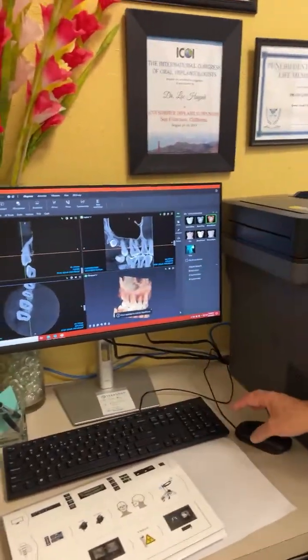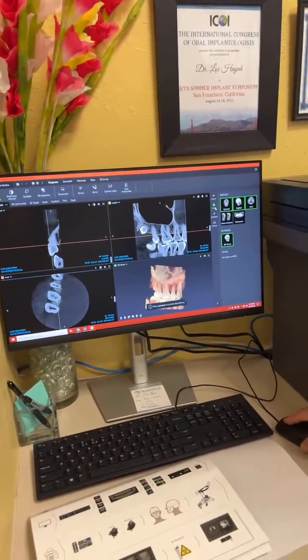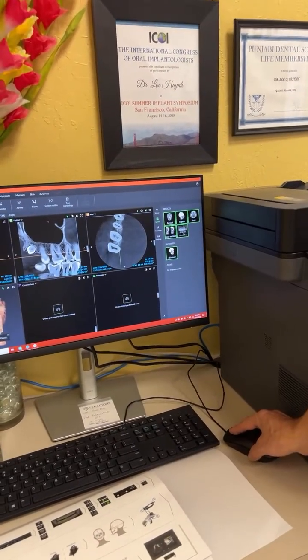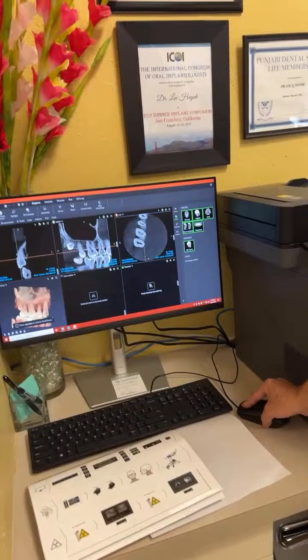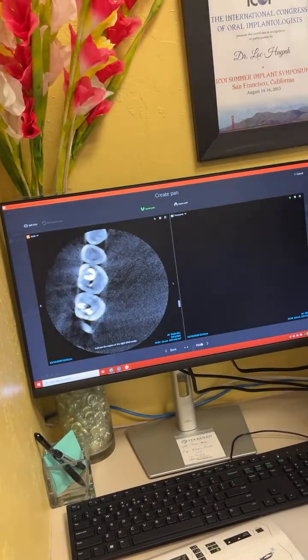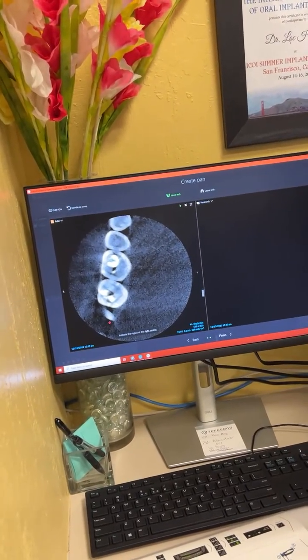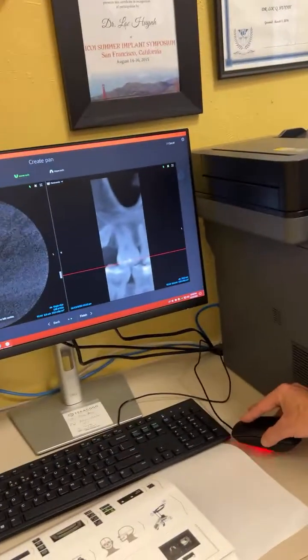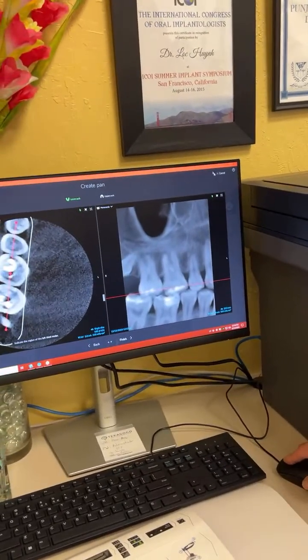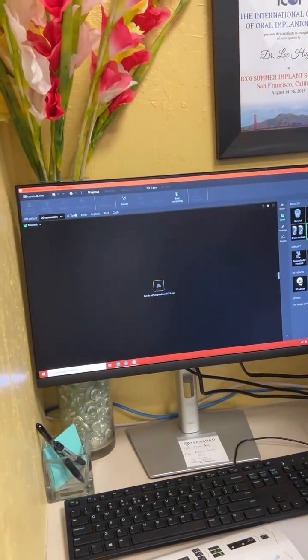Okay, you can add things. See under layout, I want to add cross sectionals here. I want to add panoramic. This is not a great pano, obviously. It's not enough data to make a pano. I didn't want you to expose too much. Just one tooth is good enough to have a lot of information on. Not enough data to make a pano, but you could. Here's 3D pano. Not going to work in this case.